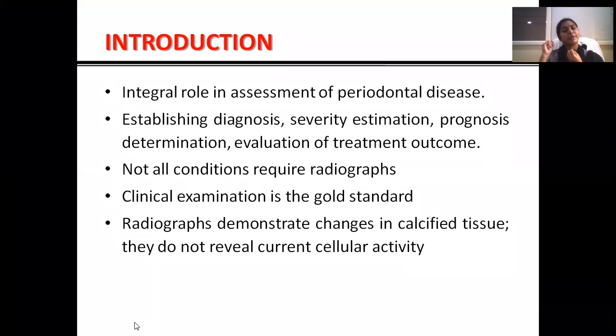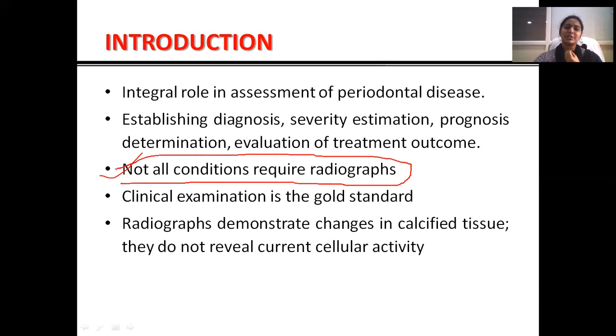But I want to emphasize an important point here. Not all conditions require radiographs. Radiographs should be taken based on specific situations. We should not take radiographs by policy. Clinical examination is always the gold standard.